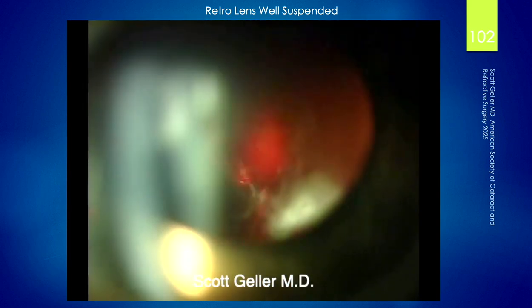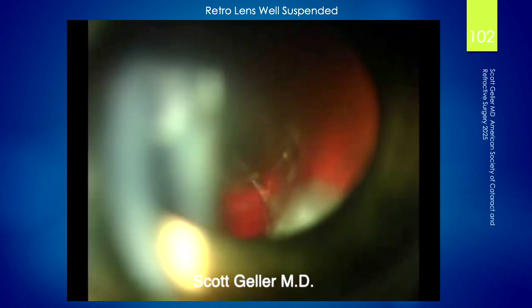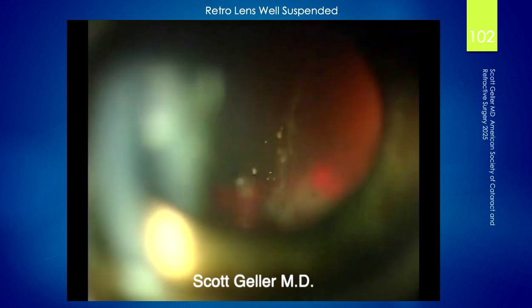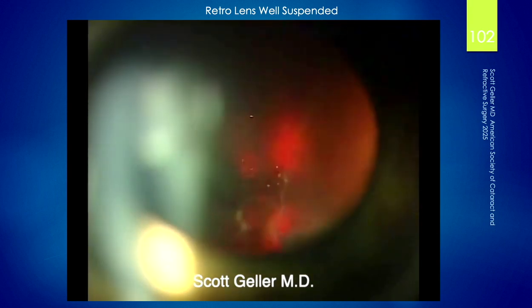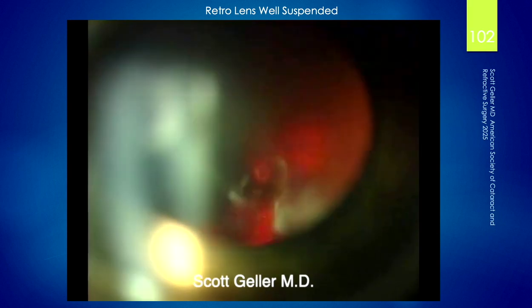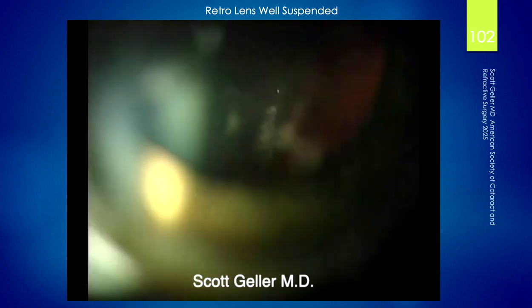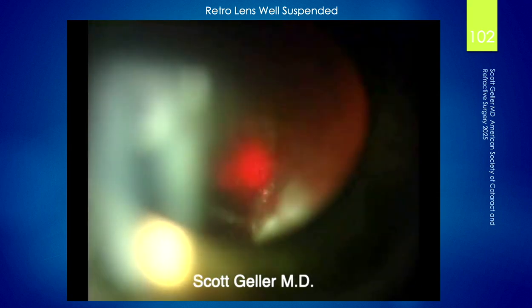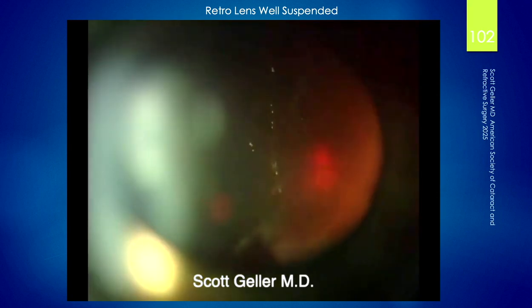Next session, still in the mid-vitreous. I go back, start to cut the strands, but you can see it's much further away at this point. It's a work in progress.